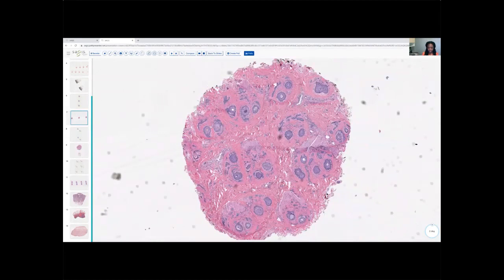Now, when we see inflammation and this catagen telogen shift, we have to consider that it's just the inflammation itself that causes transition. So it's not quite a specific finding. When you see it with inflammation, it really just tells you that there's a robust enough inflammation that you're starting to get this kind of shift over. And then in terms of density, honestly, follicular density, it's mostly preserved.